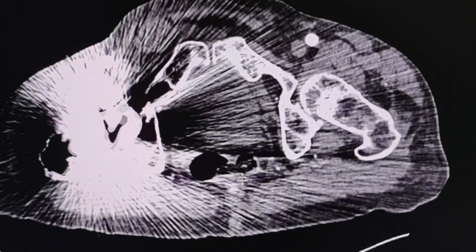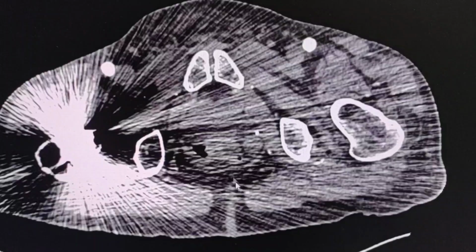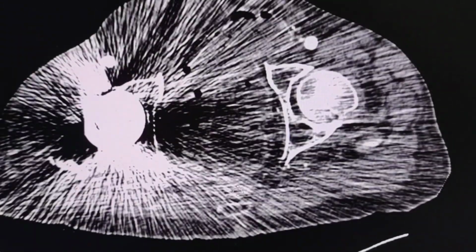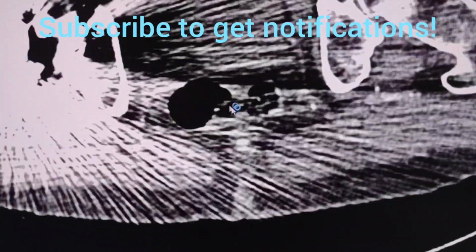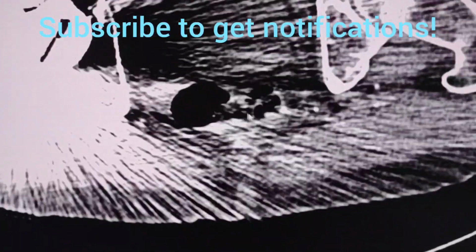It's very important to see if the rectum is empty or it is full of feces. And despite the fact that there are some artifacts here, we can see that the rectum is not dilated. Actually, it's collapsed. Okay. There are some feces, of course, some gas, but it's not pathologically dilated.